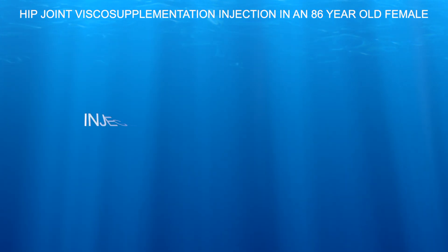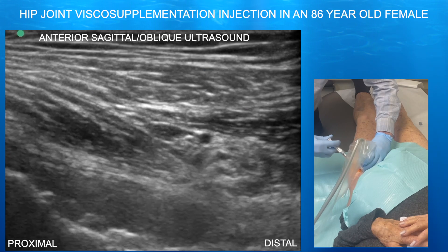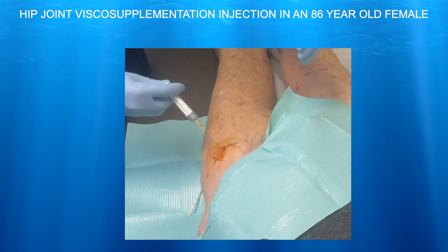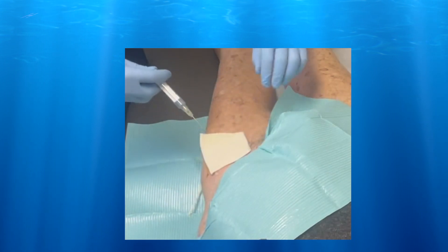Here you can see the injection spreading nicely throughout the joint. Here we're just looking at it in slow motion — you can see how the visco-supplementation is spreading throughout that anterior recess towards the femoral head.